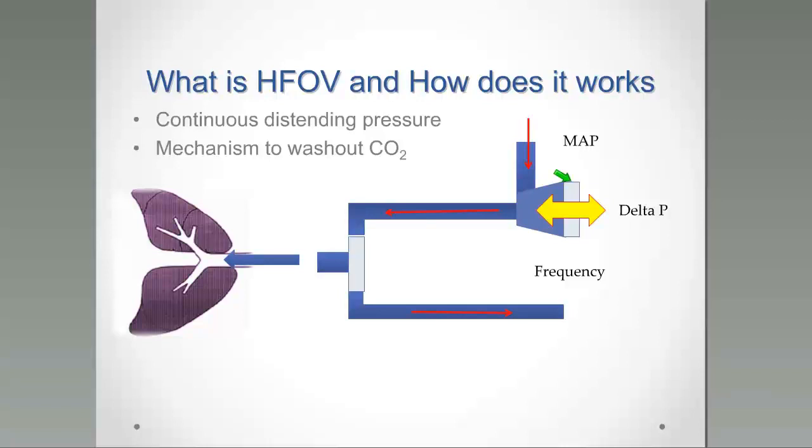This energy is going to be transmitted into the lungs as very small airway pressures. This small airway pressure is going to be generated at a very fast rate, and this transmission of energy is going to contribute to the gas exchange in the lungs.